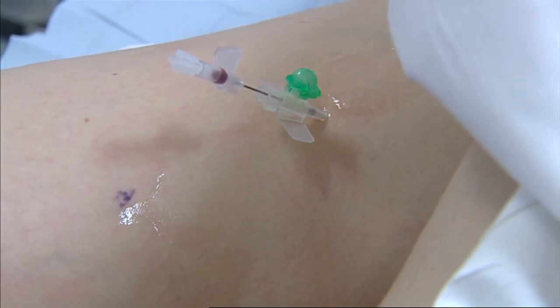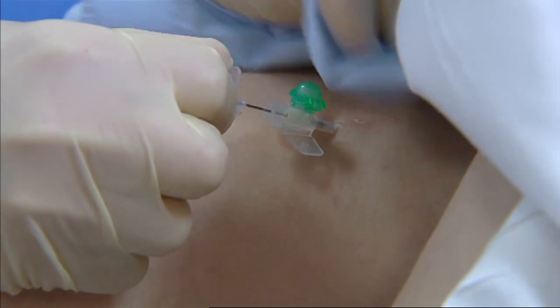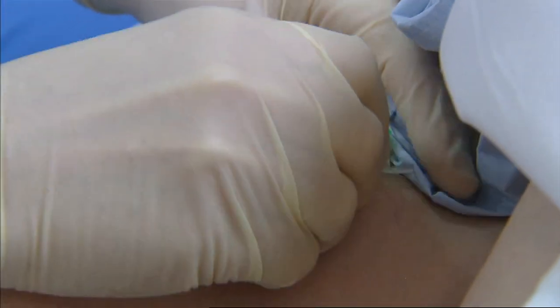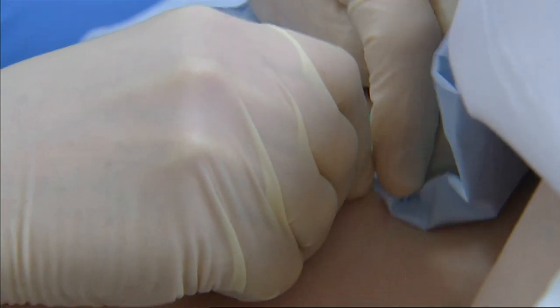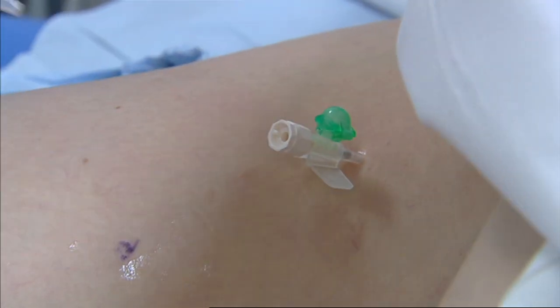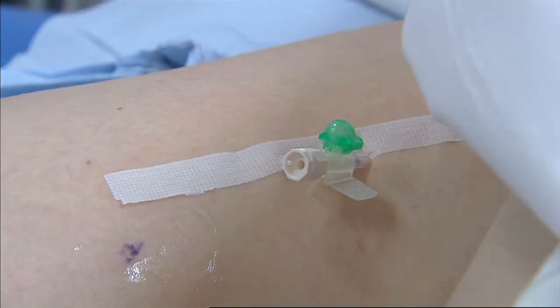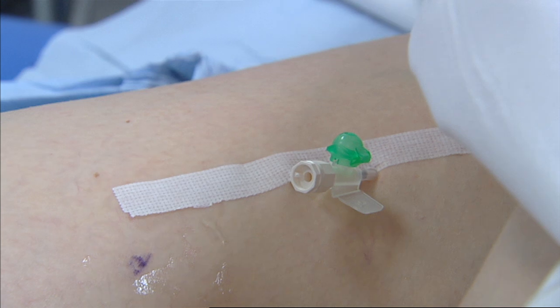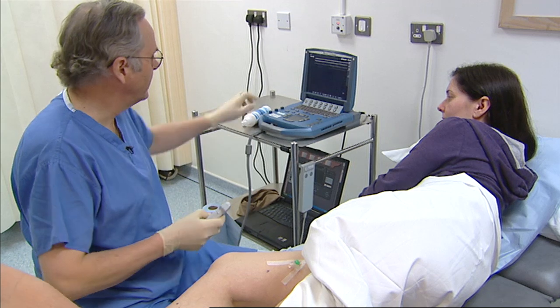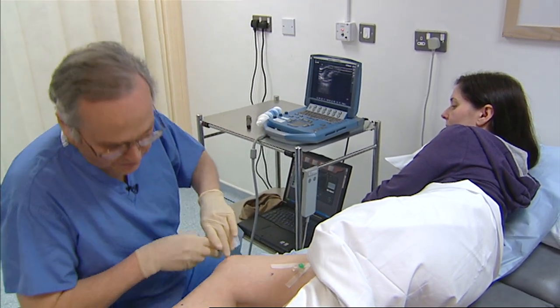Then we're in exactly the right place to make an injection of foam. We put all of these things in, and then when we're ready to go, we'll introduce the foam, which is precisely what was done last time. The tip of the needle is in exactly the right place, and then we'll do the same again.